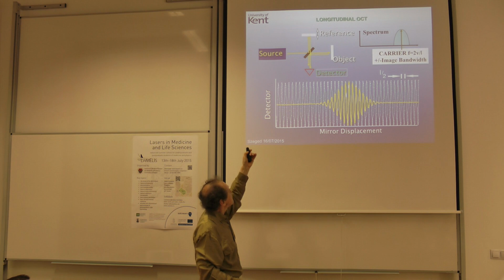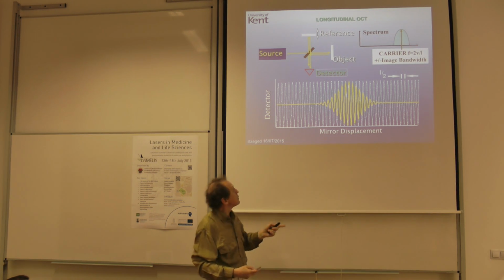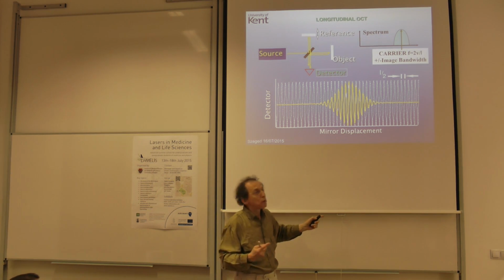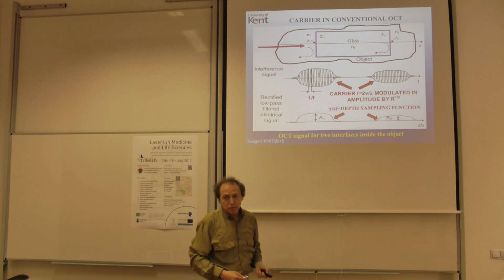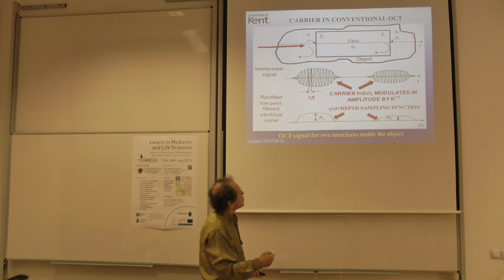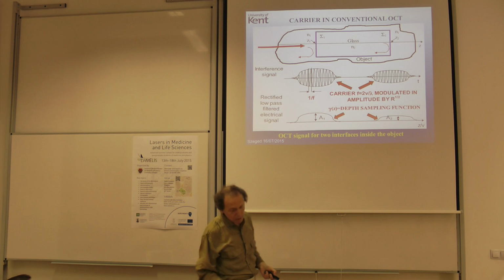So you have to replace the laser. If you use the laser, this is what you obtain. You will obtain interference all the time. However, if you put more colors than those in a monochromatic laser, your number of peaks will be restricted to the yellow one. So let's say that now we complicated it, and instead of having one mirror, let's place in the object two mirrors. So we have here sigma 1 and sigma 2. This doesn't show very well.